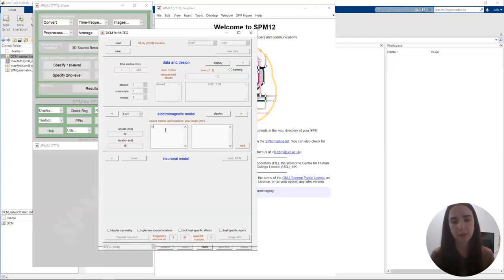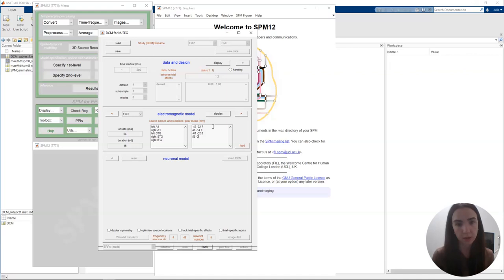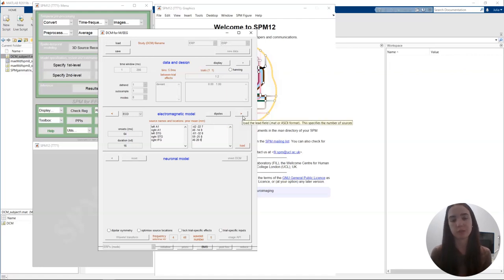Let's go back to MATLAB where we'll start typing in our source labels: left A1, right A1, left STG, right STG, and right IFG. Once we've done that, we can type in the coordinates one by one into the second window. If you have a file saved that contains this information, you can simply load it using the Load button instead of typing them in every time — this comes in handy if you're rerunning a lot of models. Then we press the arrow and move on to the next section.